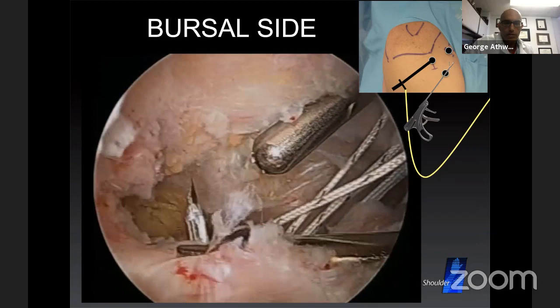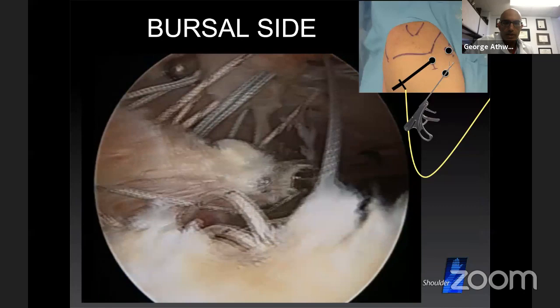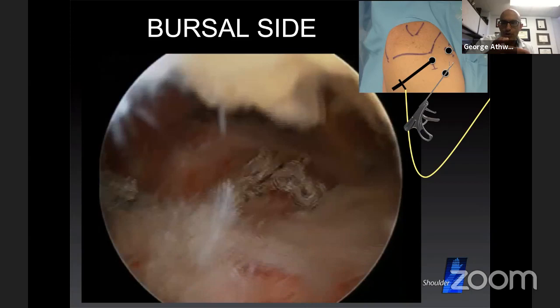There we go. Pick up the suture. And then on the way out, I'll pick up my next suture. So you can see that in time, you get a finely honed sewing machine where you're sewing all the way up. And so now I've tied all my sutures.